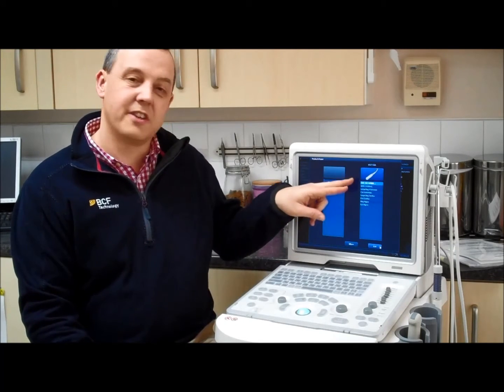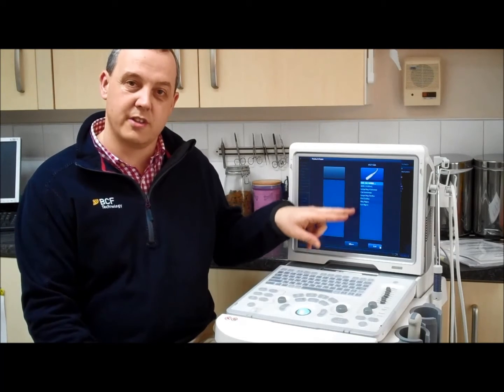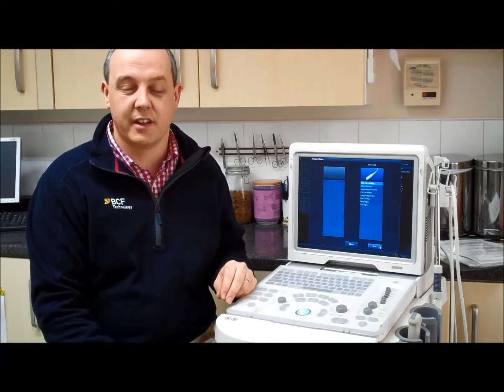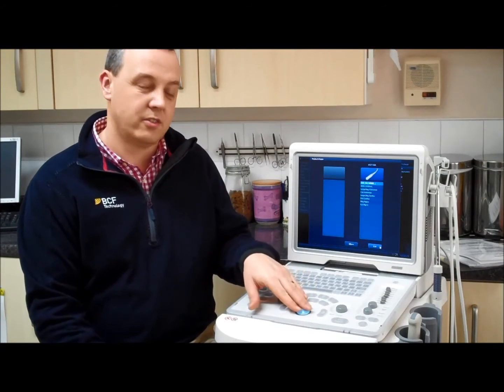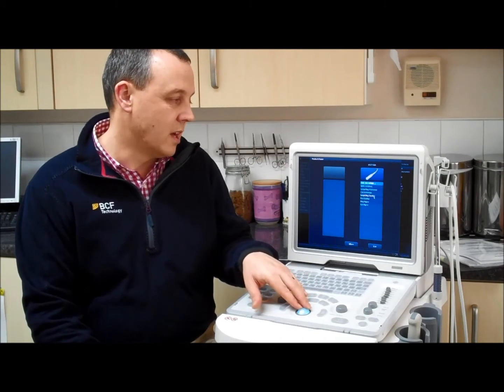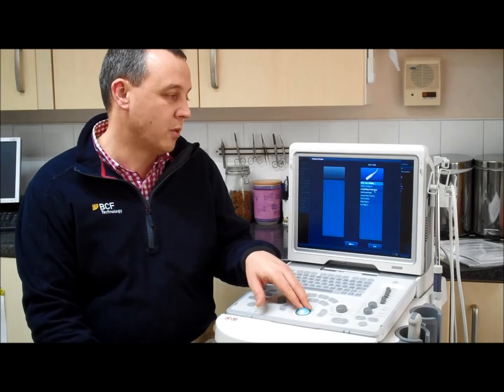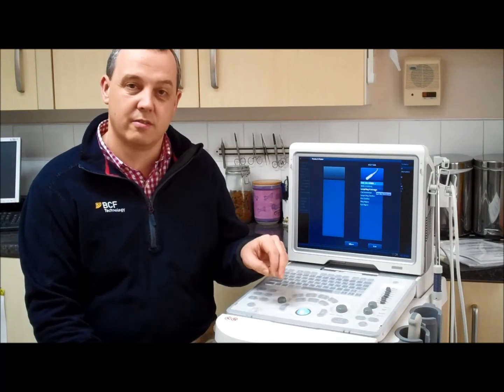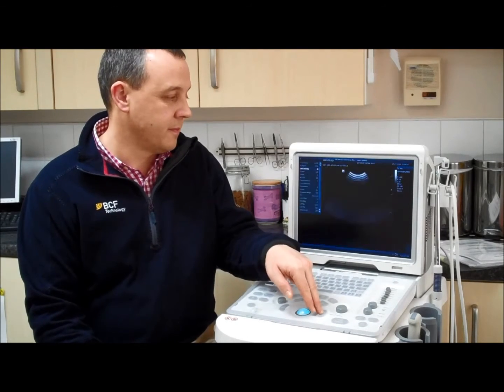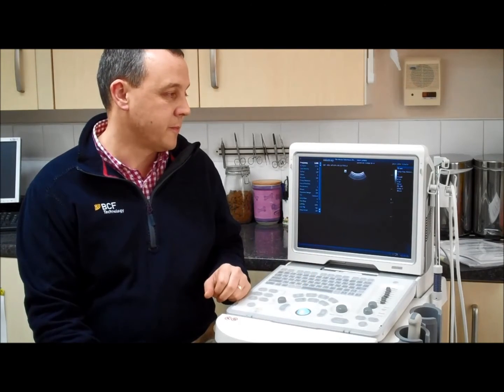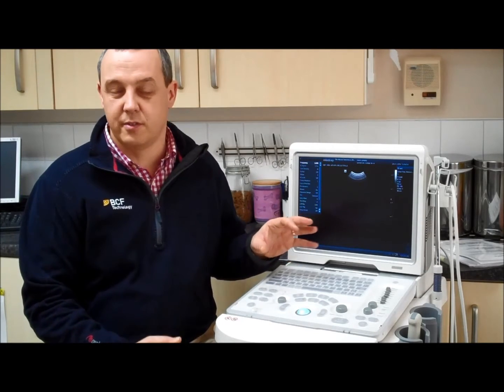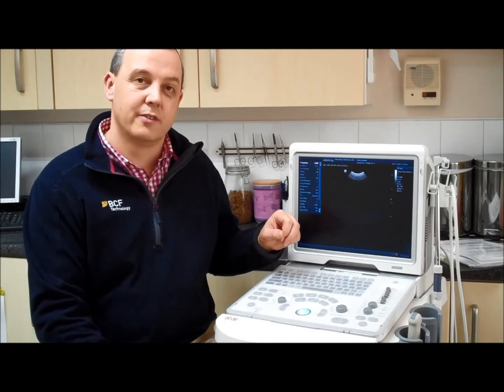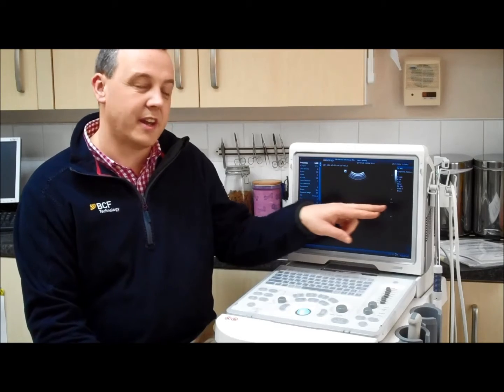As you can see here, we've got a range of presets: dog cardiac, cat cardiac, dog abdomen. In this example, we'll select large dog abdomen.